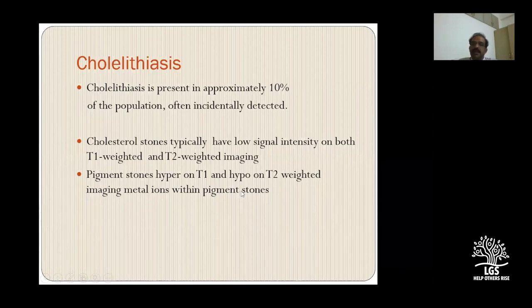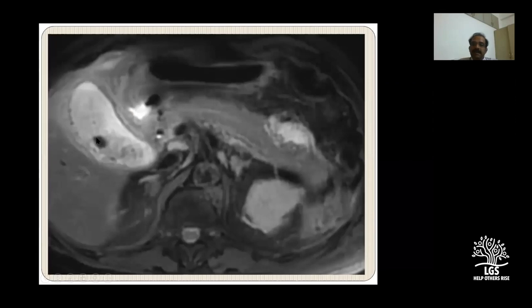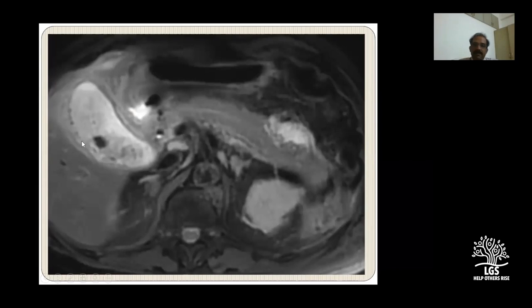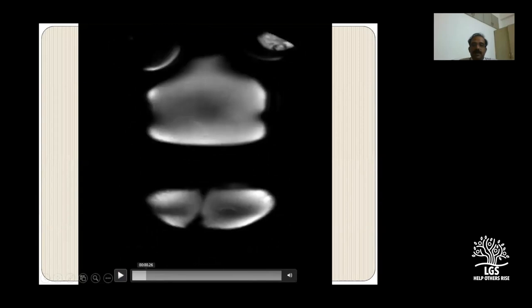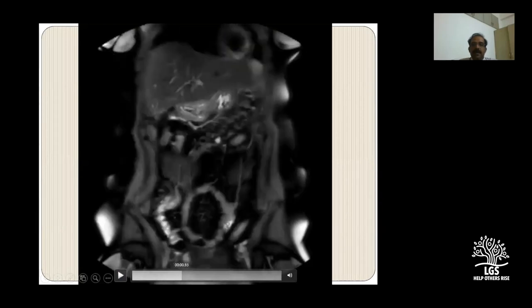This is a classic example - a T2-weighted image showing a well-defined calculus inside the gallbladder. You can also see a lot of sludge and microcalculi, which form the nidus for later calculus development. You see a horizontal fluid level - this is the true signal in the bile. The slightly grayish area indicates a lot of sludge within the gallbladder, which is quite overdistended - possibly suggesting some obstruction downstream.